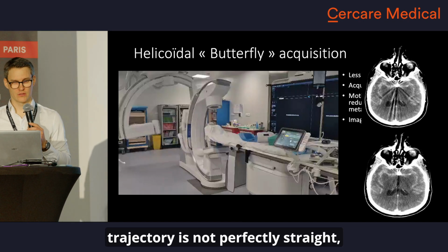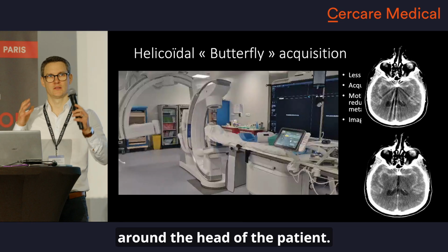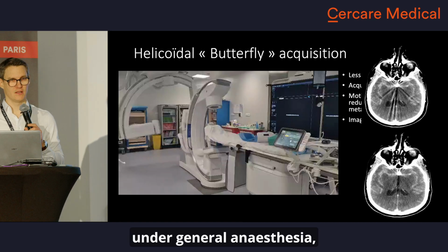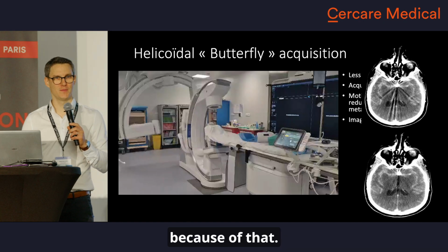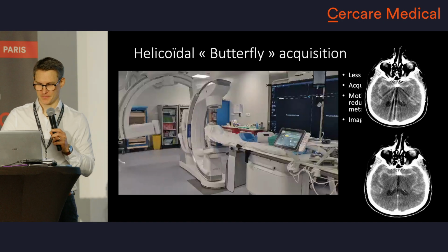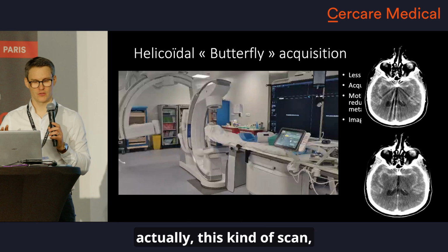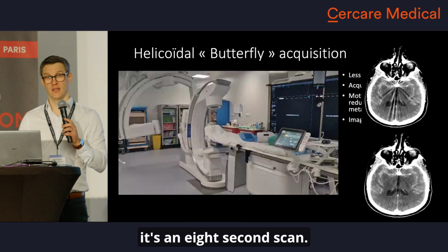As you see, the trajectory is not perfectly straight, but it moves a little bit around the head of the patient. So when you got a patient under general anesthesia, you just have to take care that one probe doesn't fall away because of that. But finally, it provides far better images. The thing is, actually, this kind of scan, even for research, is an 8-second scan.